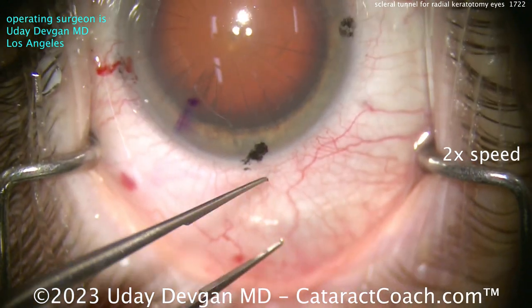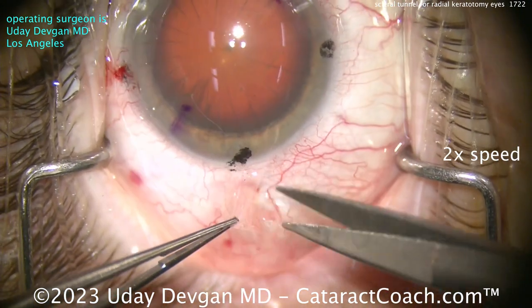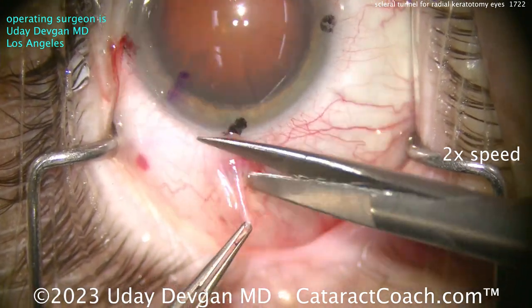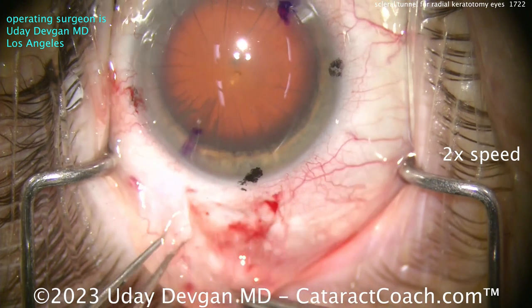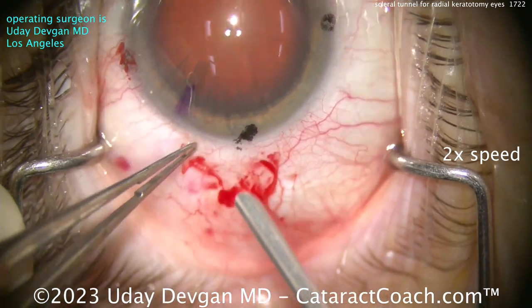But now it's time for a peritomy. We have to open up the conjunctiva because we're going to do a scleral tunnel. I'm sitting superiorly here on this eye — this is a right eye — and you can see we're using the 0.12 forceps and some scissors to create a peritomy here.